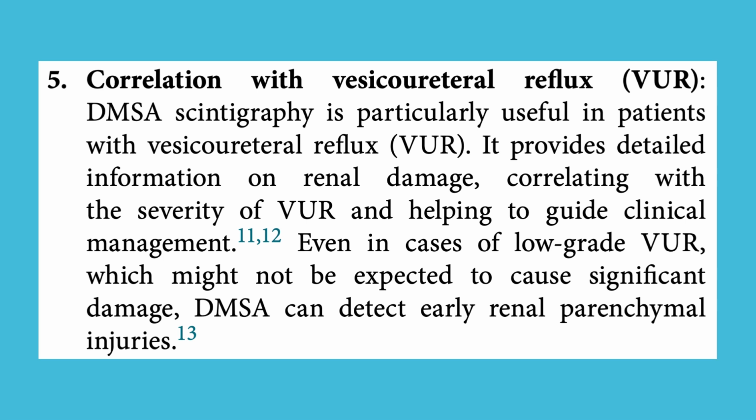5. Correlation with vesicoureteral reflux, VUR. DMSA scintigraphy is particularly useful in patients with vesicoureteral reflux, VUR. It provides detailed information on renal damage, correlating with the severity of VUR and helping to guide clinical management. Even in cases of low-grade VUR, which might not be expected to cause significant damage, DMSA can detect early renal parenchymal injuries.